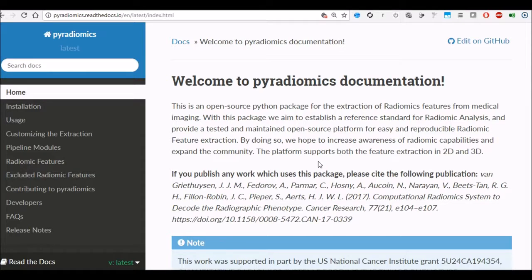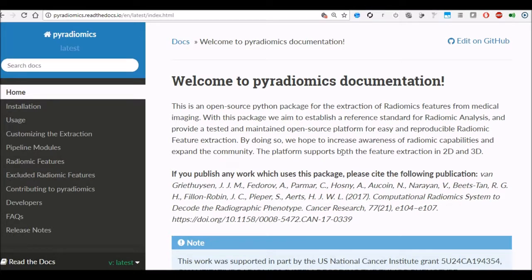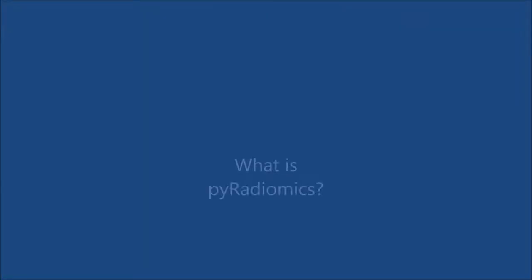Today I will be talking about using PyRadiomics and how to install it on your Windows 10 machine. PyRadiomics is a Python based package which is used for extracting radiomics features from medical images.